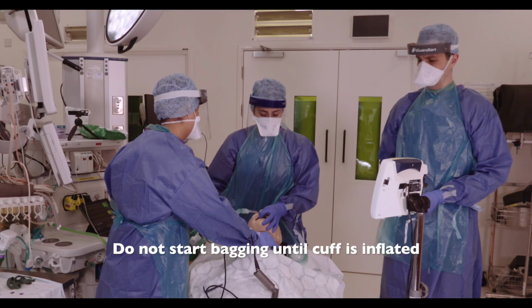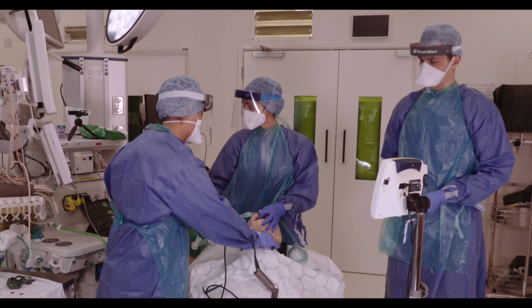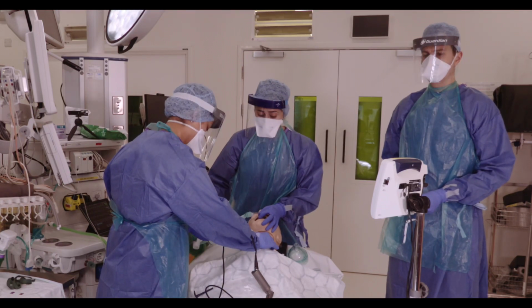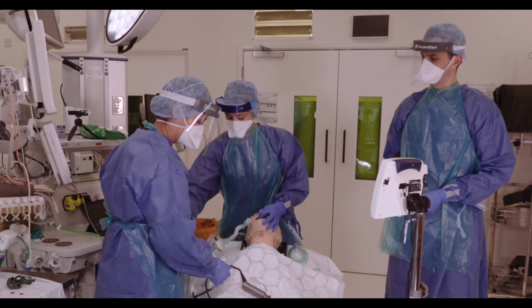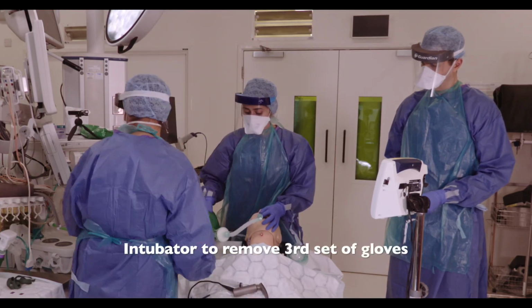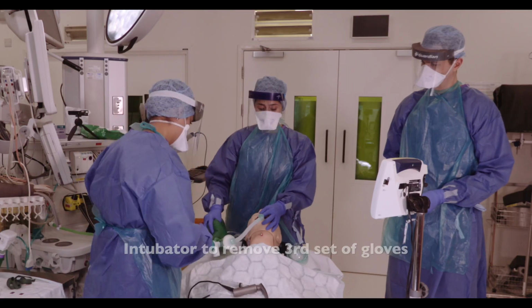Good chest wall movement bilaterally, we've got misting in the tube. I can see that we've got some CO2 on our monitor. I'm happy that's in the right place, so can I put them on the ventilator, please? My ventilator's set and ready to go, so before I disconnect and pop them on their monitor, I'll tie the tube in.